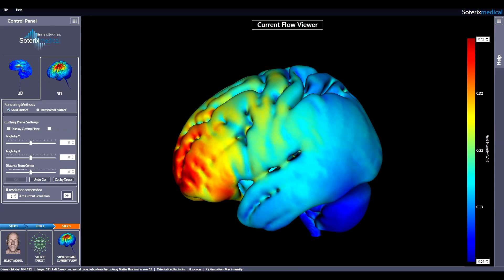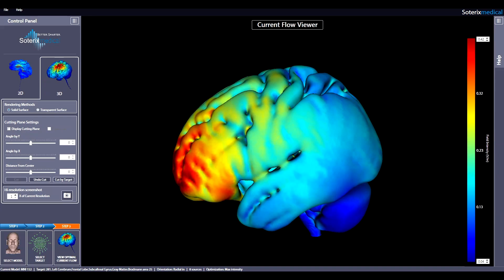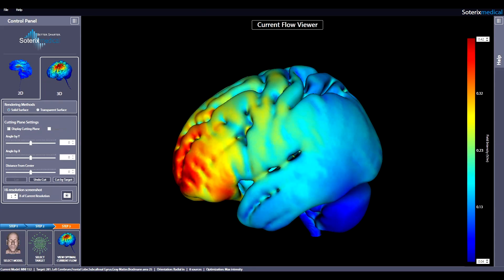This is a demonstration of how to use HD Targets by Soterics Medical. HD Targets is a simple but powerful program that allows you to achieve neuro-targeting with your Soterics Medical high-definition stimulator. Neuro-targeting allows you to identify a brain region, set stimulation constraints like how many electrodes you have available, and then automatically optimize your HD Montage to stimulate that region.